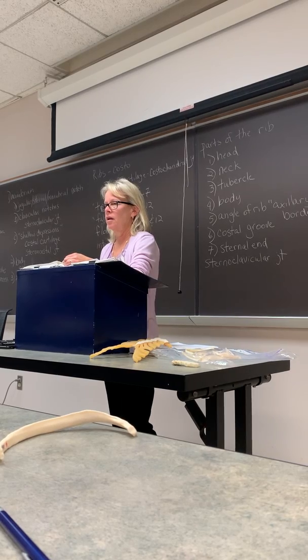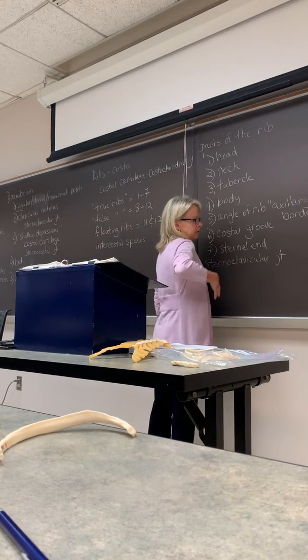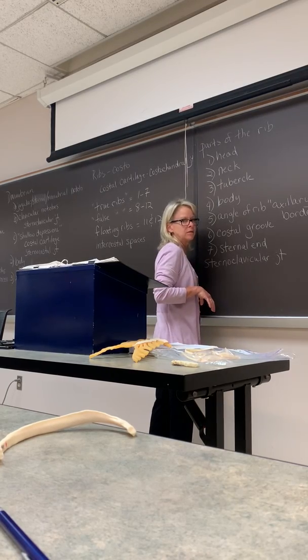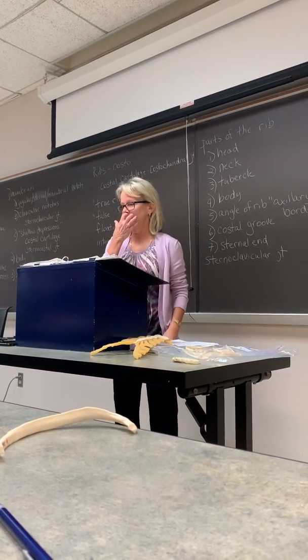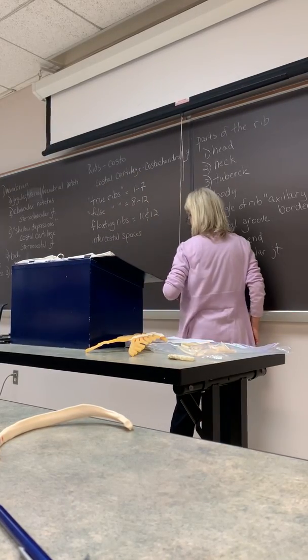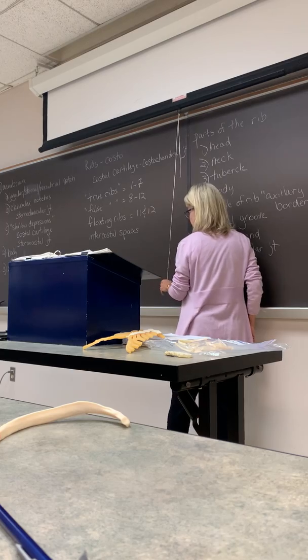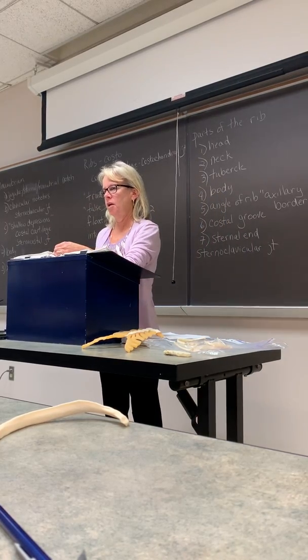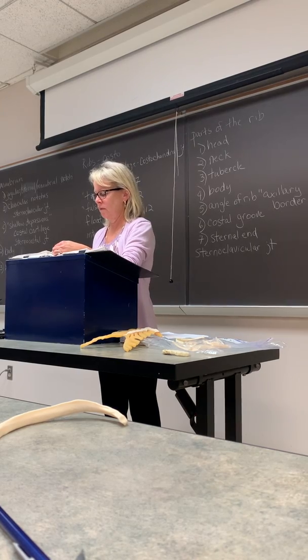LAO shows the right ribs elongated. RAO, it's the left ribs elongated. AO, affected side up. PO, affected side down.